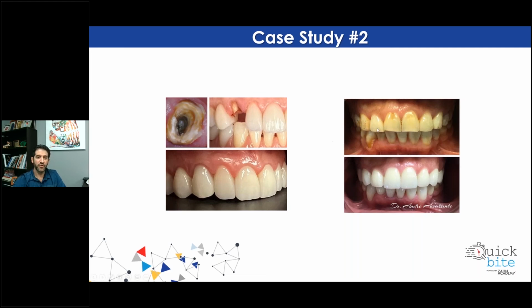And we're able to mask all this yellow dark discoloration underneath and achieve a beautiful transition of colors, translucency on incisals, and we did this with solid. We didn't apply any porcelain to this.